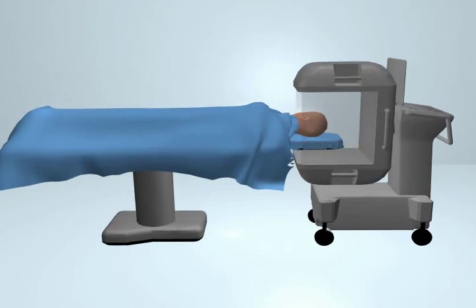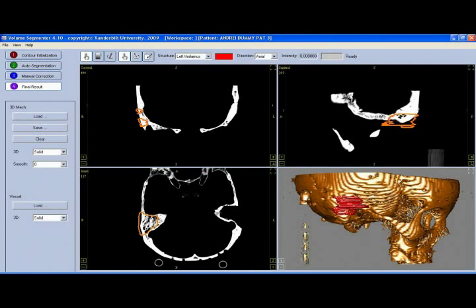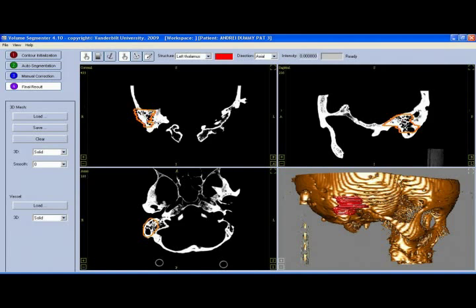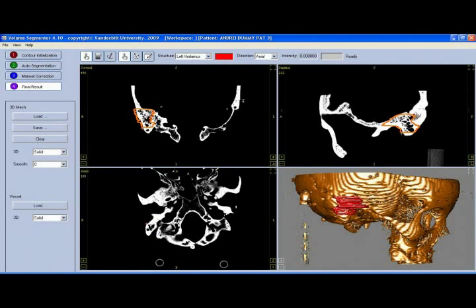After aligning CT scans with surgical anatomy, the intended trajectory or path of the drill, as controlled by the robot, can be specified on the scan.